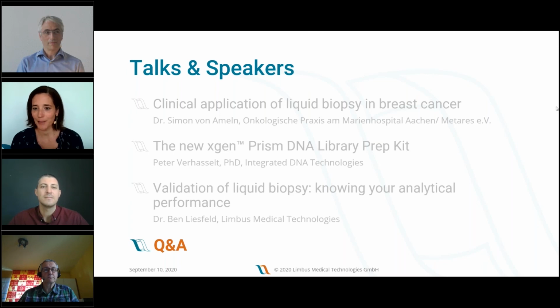One question for Peter. How do you deal with the fact that the IDT technology can detect sequencing from 100 base pairs length upwards, but not shorter ones? There's evidence that ctDNA can be found more often in the shorter fragment part of plasma DNA.